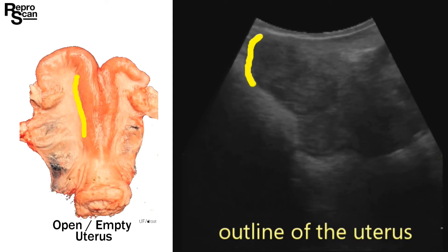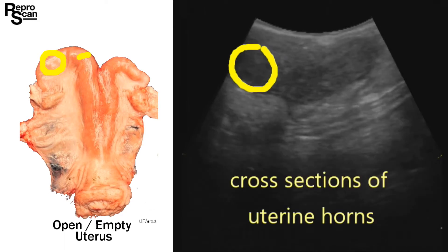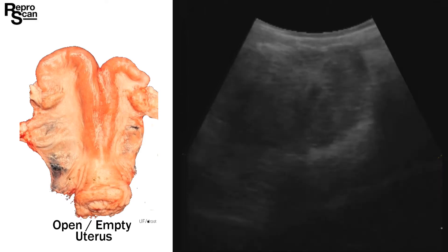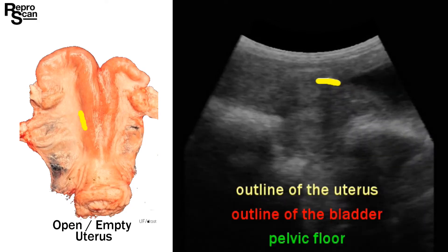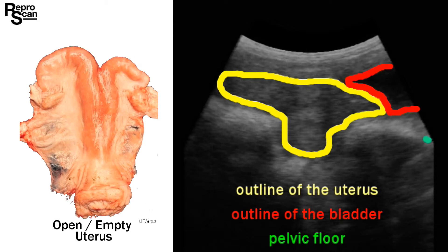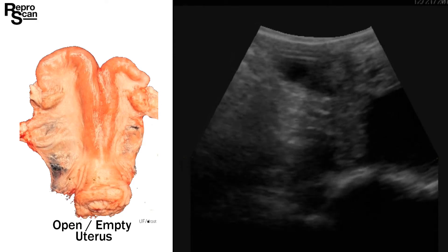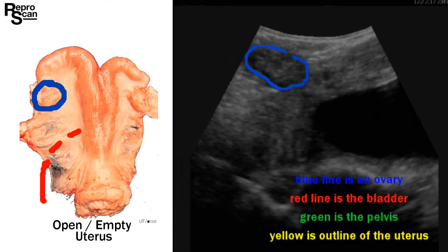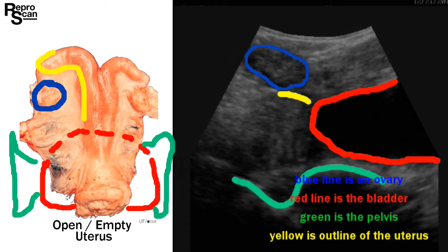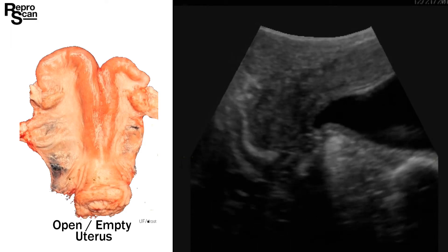We will now go through a series of 11 examinations. Here we're highlighting the uterus on the left and on the right over the image, showing cross sections on the ultrasound image. The exercise is to train people's eye to detect that slight different color of gray. In examination number two, we're circling the uterus both on the left and the right, keeping the bladder and pelvis highlighted for orientation. Here we're circling the ovary in blue and outlining the uterus in yellow.